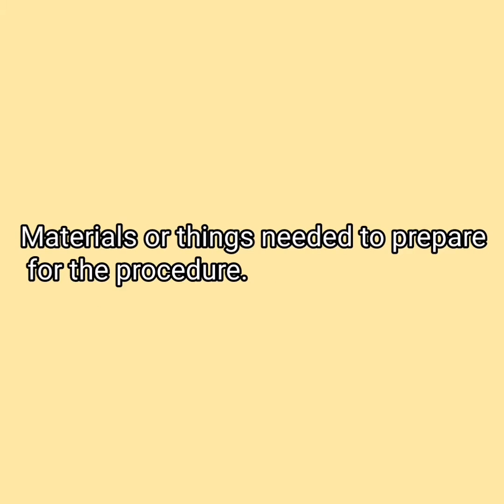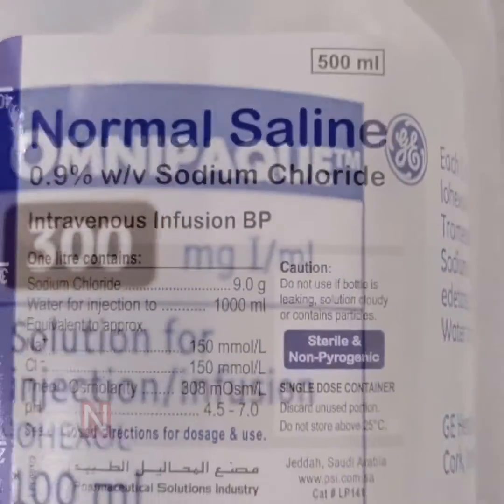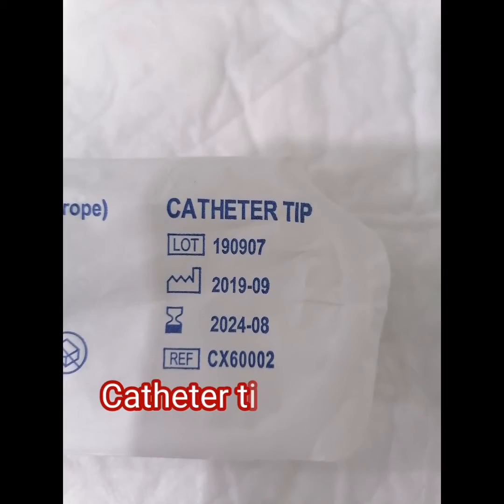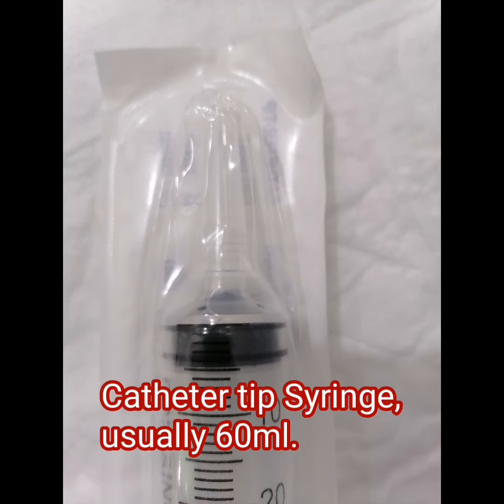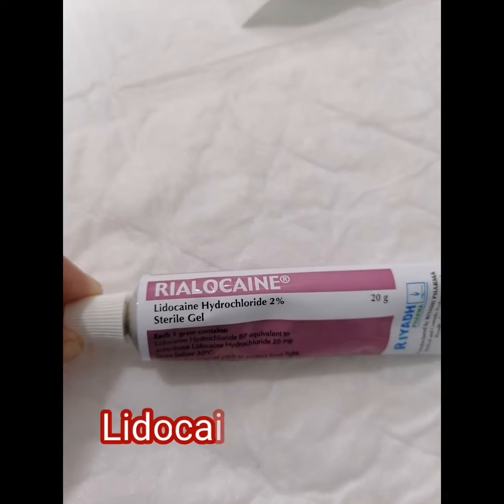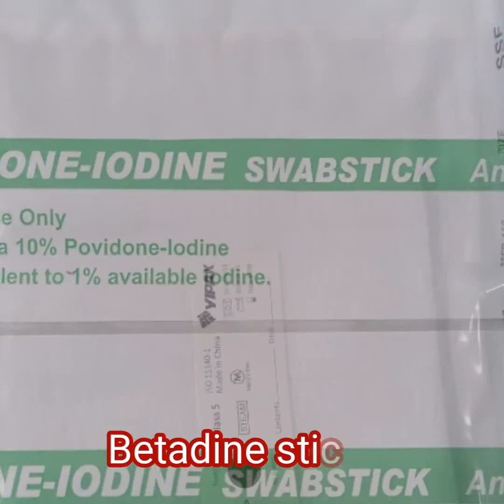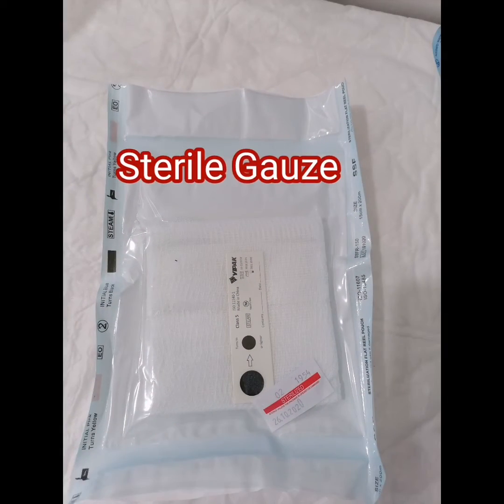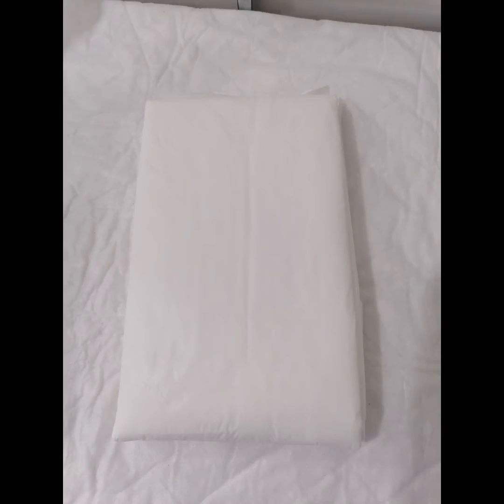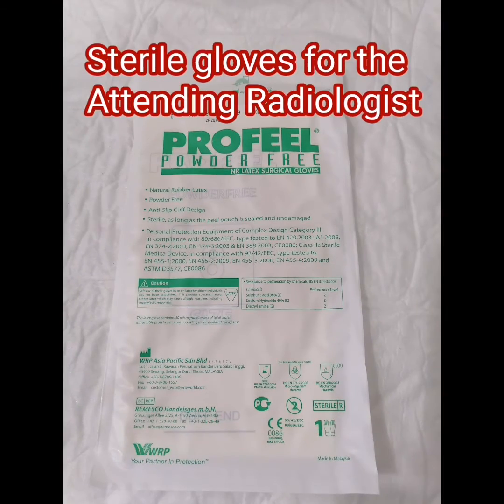Materials and things needed for the procedure: contrast media, normal saline, catheter tip syringe (usually 60 ml), lidocaine gel 2%, betadine stick, sterile gauze, sterile kidney dish, underpad, and sterile gloves for the attending radiologist.